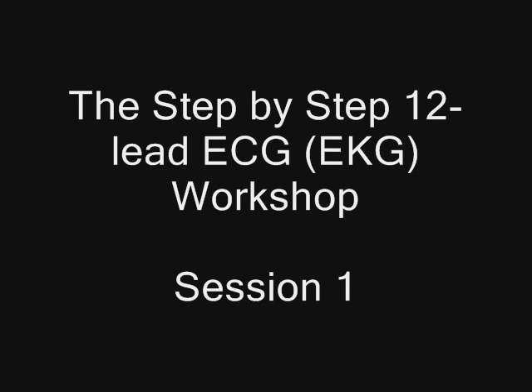I'm Dr. Richard Hatchett, a London UK-based nurse tutor and co-editor of the books Cardiac Nursing, A Comprehensive Guide and Nurse-Led Clinics Practice Issues, and I've been teaching 12-lead ECG interpretation for over 20 years. Now, I've put this workshop together for those of you with a basic knowledge or an almost absent knowledge of 12-lead ECG interpretation. It may have been something you've been wanting to do for a while, but you just haven't had the time. This is the workshop for you.